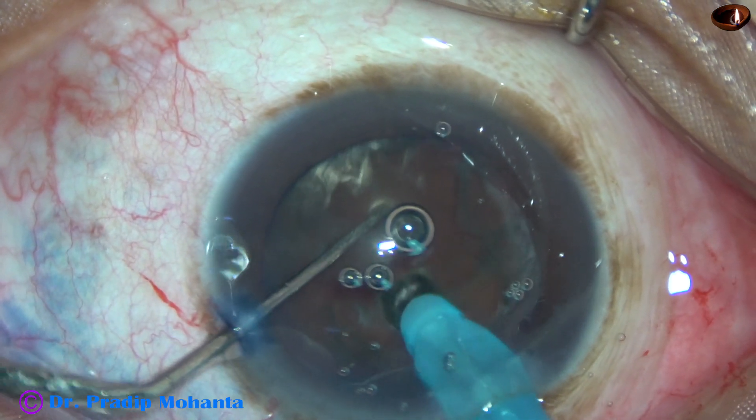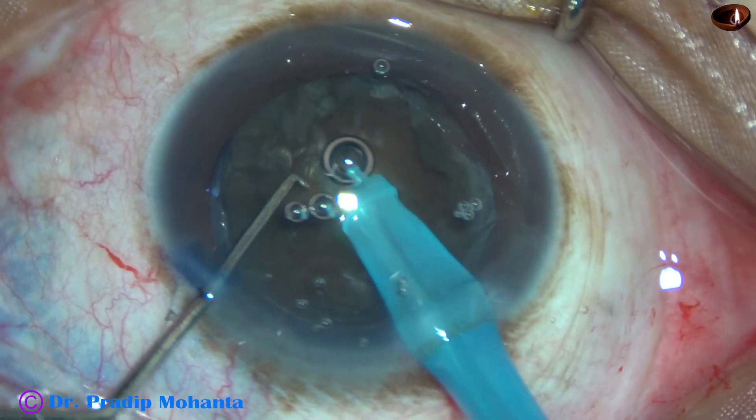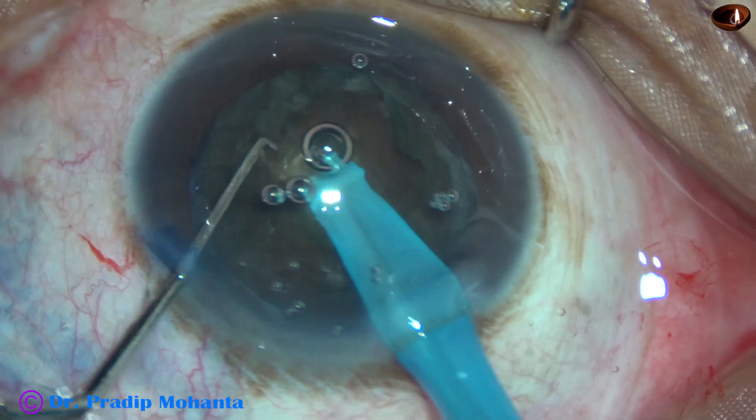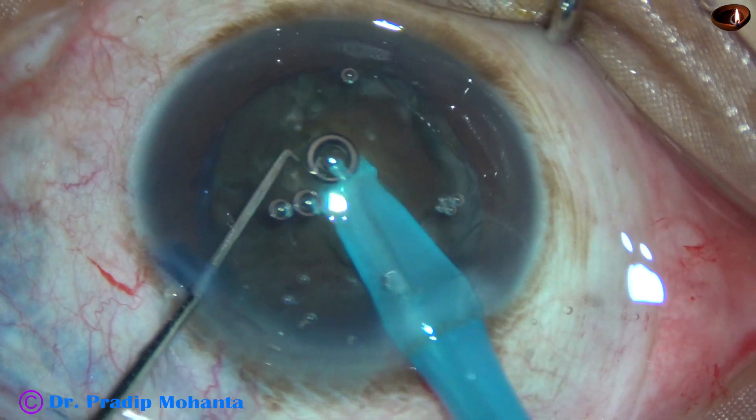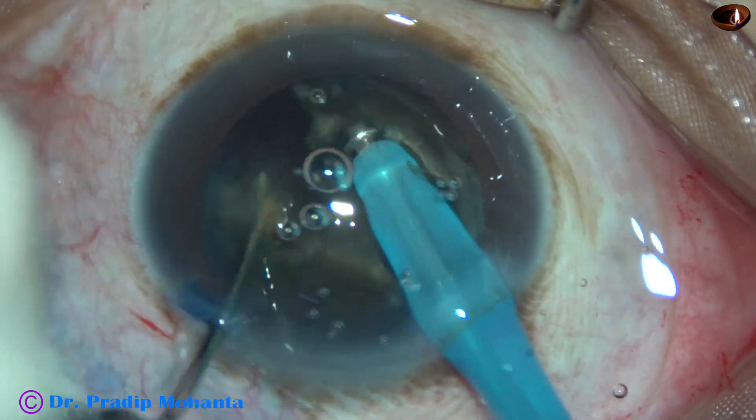Here it is — the tube goes through the nucleus towards the opposite equator, crosses the central part, reaches almost near the opposite equator, and then it is chopped.